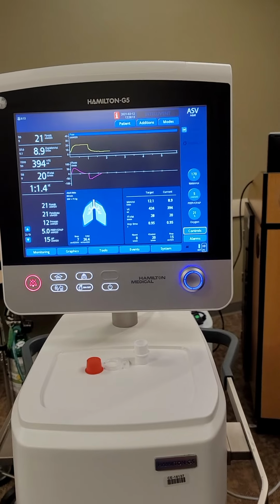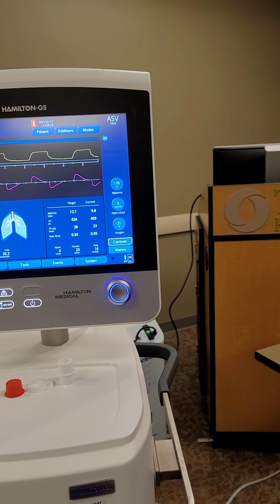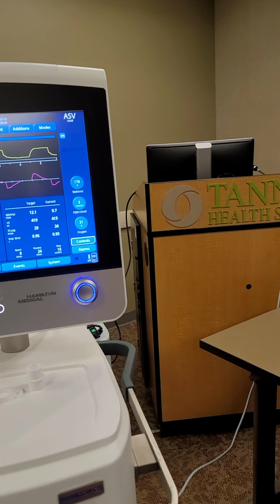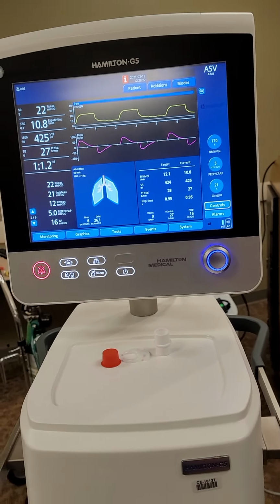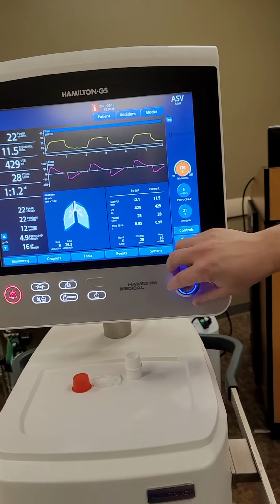One quick question. I think I remember a previous rep saying, if they're on like the respiratory pressure here, if it's less than 8, and the patient is extubatable, is alert and awake, we can extubate them on, I mean, ASV.